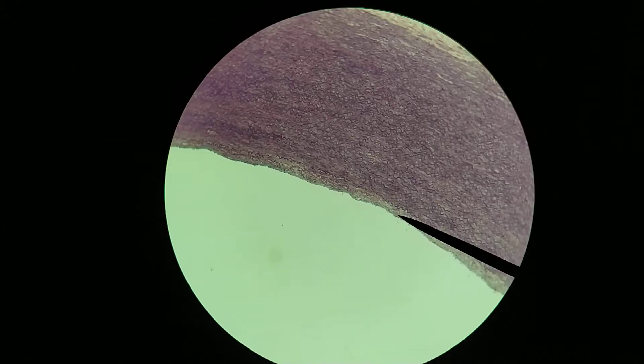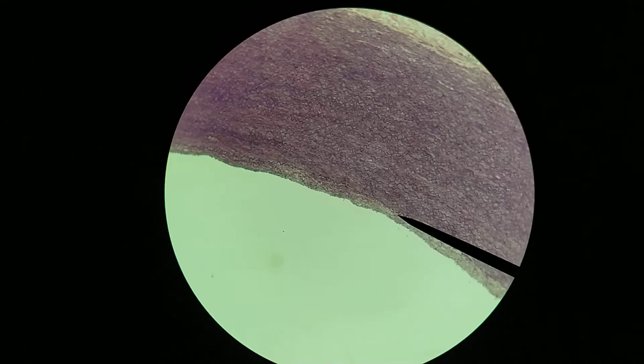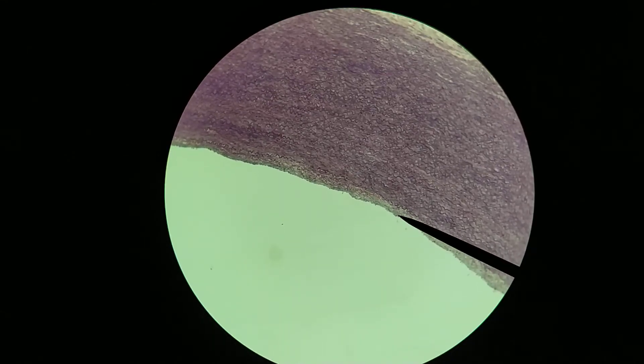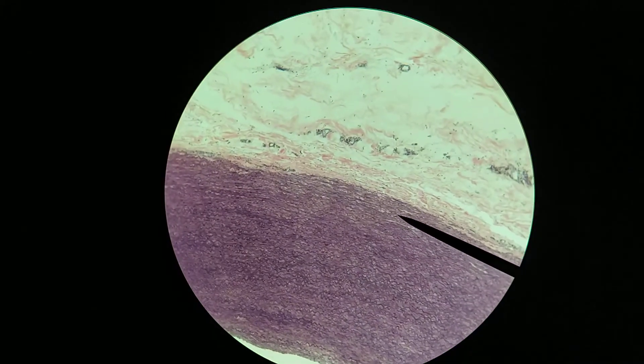This more lightly staining area is the internal layer, so the tunica intima, right there. And then we have this more intensely staining region right there. This is, again, the tunica media.